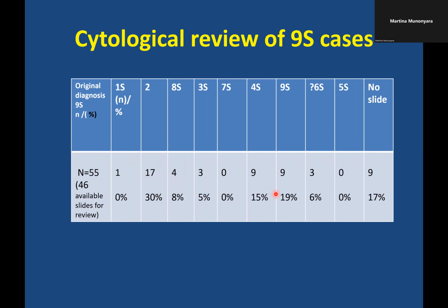Interestingly, I would have put some of them as severe, and I only called 19% of them borderline endocervical, and 6% I would have pushed up to query endocervical dyskaryosis. Okay, but we know that this is a very subjective category, and I might add that when you do an audit, you can be very prescient. It is not quite the same as capturing what it is to do day-to-day reporting.